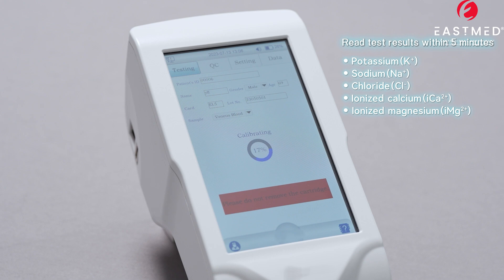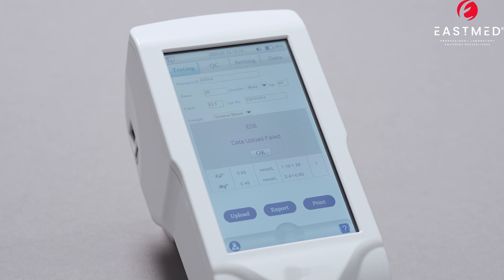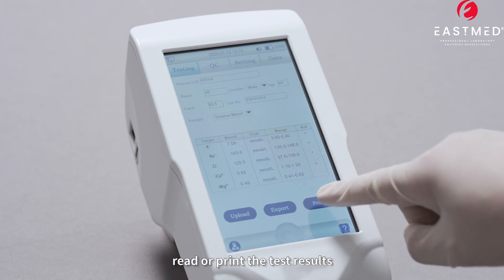Read test results within 5 minutes: potassium, sodium, chloride, ionized calcium, and ionized magnesium. Print the test results.